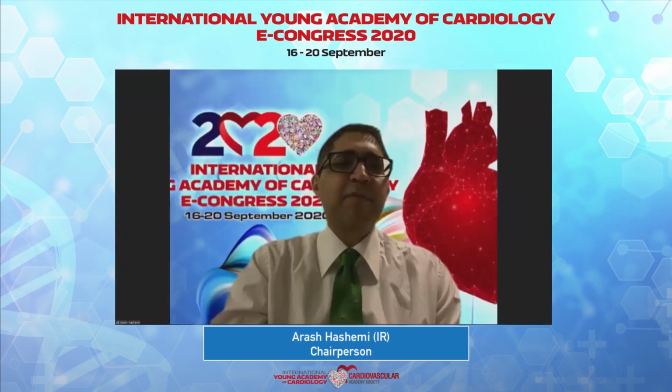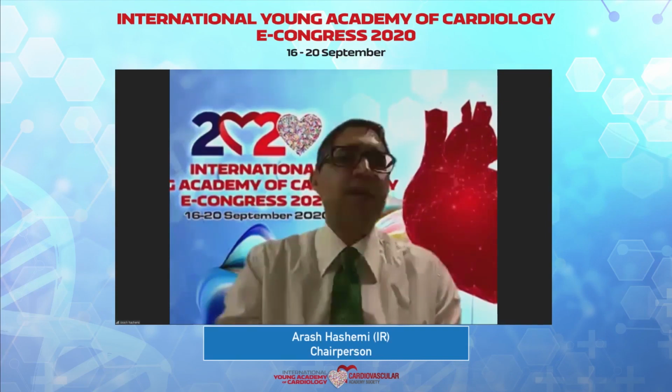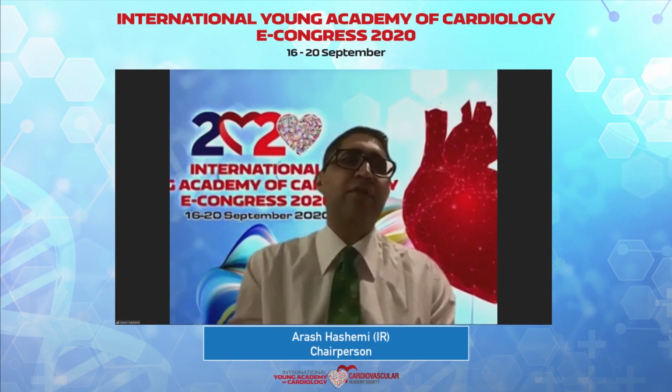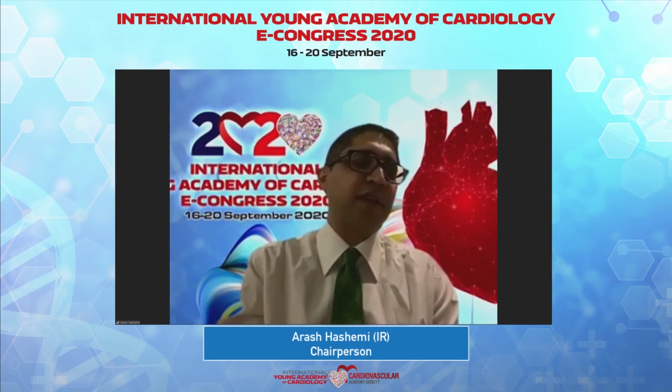Thank you very much. And my last question is directed to Dr. Sarraf. We have a very short time, but I want to take your input on patient selection for TAVR. I think it's very important which kind of valve we have at our disposal, and that plays a very significant role in selecting the patient. And what I think is a little bit missing in the trials is whether the patient, for example, has 3-vessel coronary artery disease, whether to do TAVR and stenting, or go for CABG or SAVR. I think there's a missing gap in the trials there. What's your take on that?